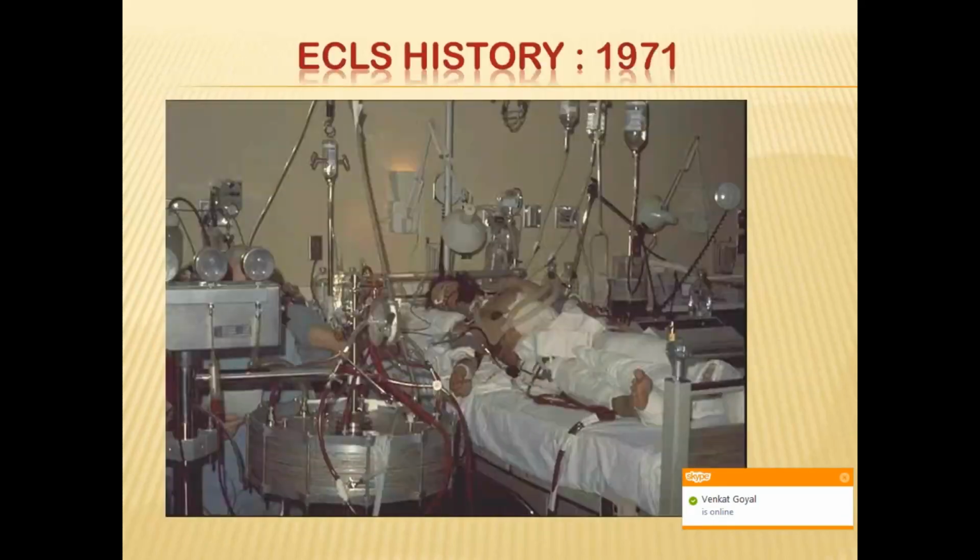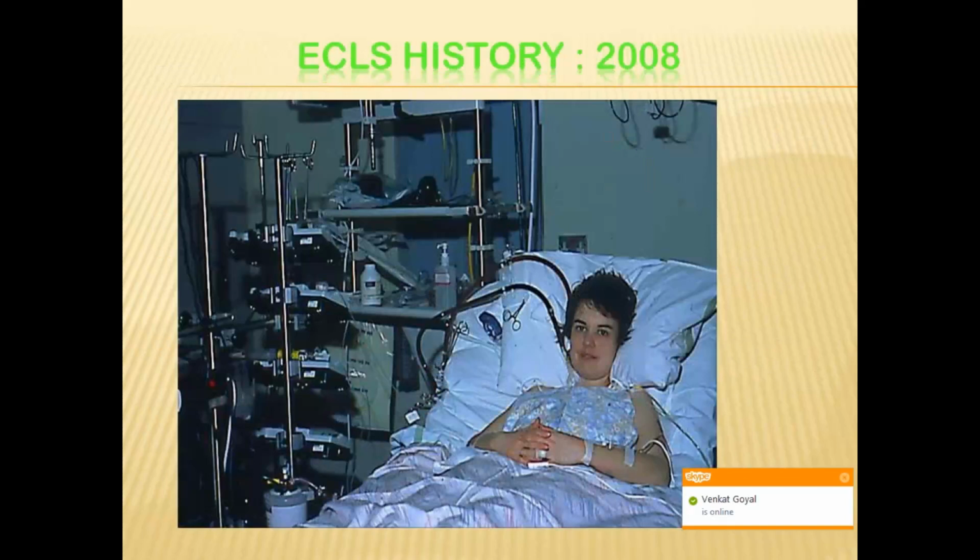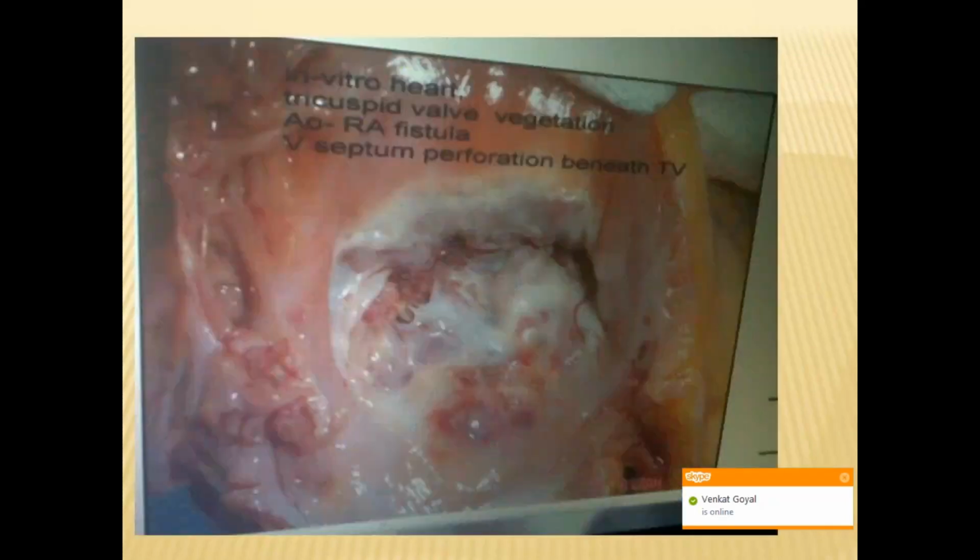The course history I am going to discuss as a separate topic. But this is the ECMO when it was started in 1971, and you have ECMO like this in 2008, where people opt for an ECMO rather than be on a ventilator.